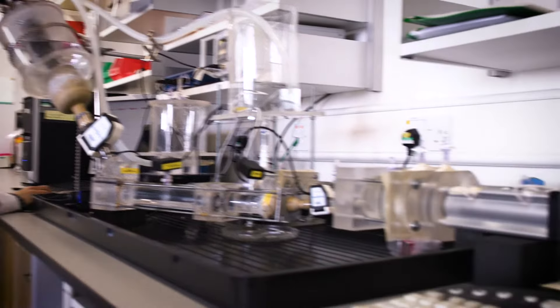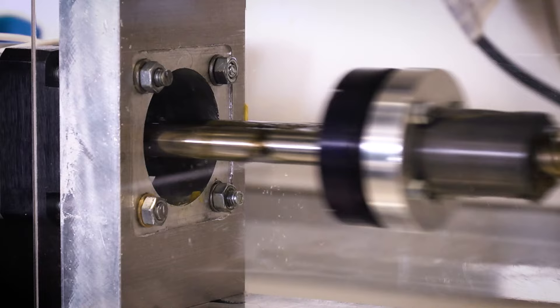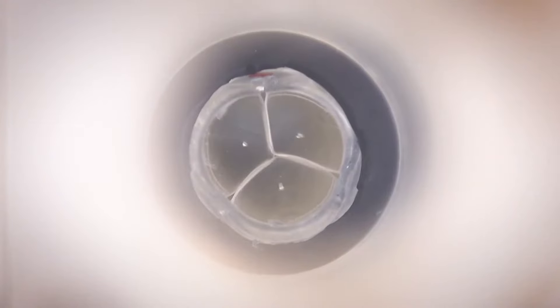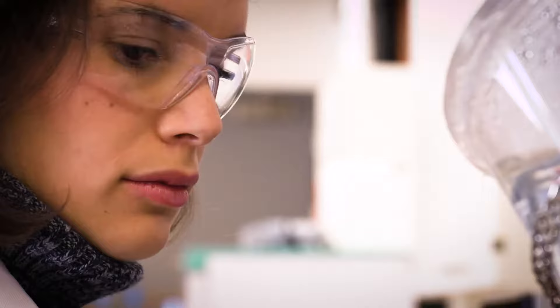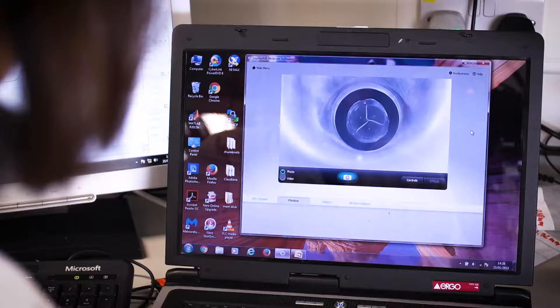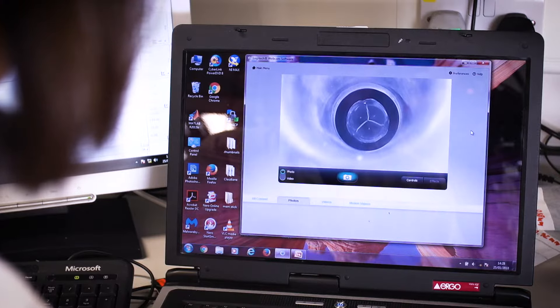We do hydrodynamic testing in a pulse duplicator, and that tests the cyclical beat at different rates and pressures, and then we can see how it performs in terms of how much it opens and how well it closes.